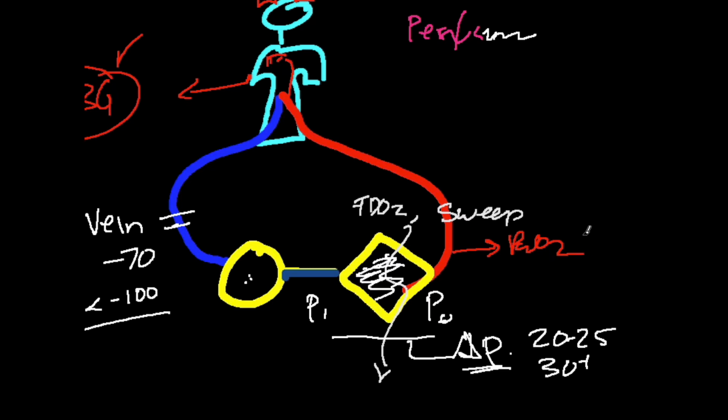When an oxygenator is brand new, it's going to be something in the 400s. So again, if you're starting to get lower values of PaO2, and that's in the context of delta P's going up, then you're going to look pretty hard to make sure there are not some clots in there, and you're going to have to seriously consider whether that oxygenator is going to last. You might have to intensify your anticoagulation, but a lot of times it just means that there's a deposit of stuff that really isn't clot per se, but just junk that's causing things to be very sluggish.